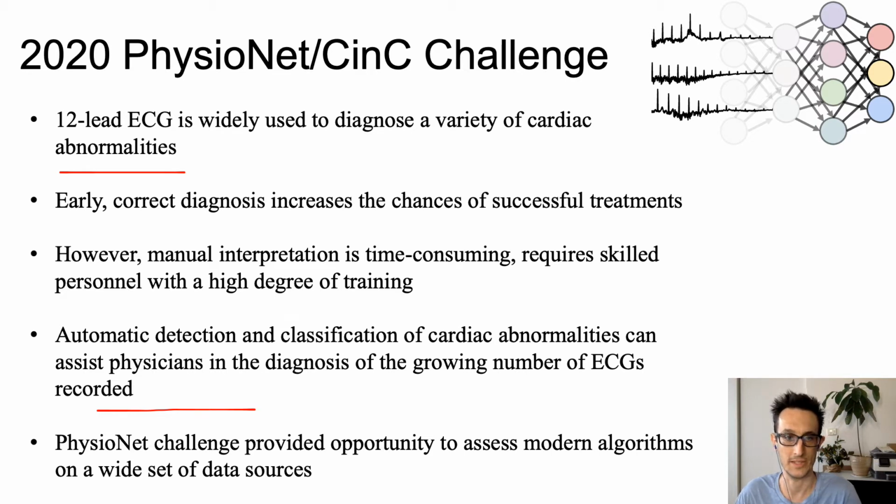being recorded these days. What the 2020 PhysioNet Challenge allowed was an opportunity to assess modern algorithms on a very large data set that came from a wide set of sources.